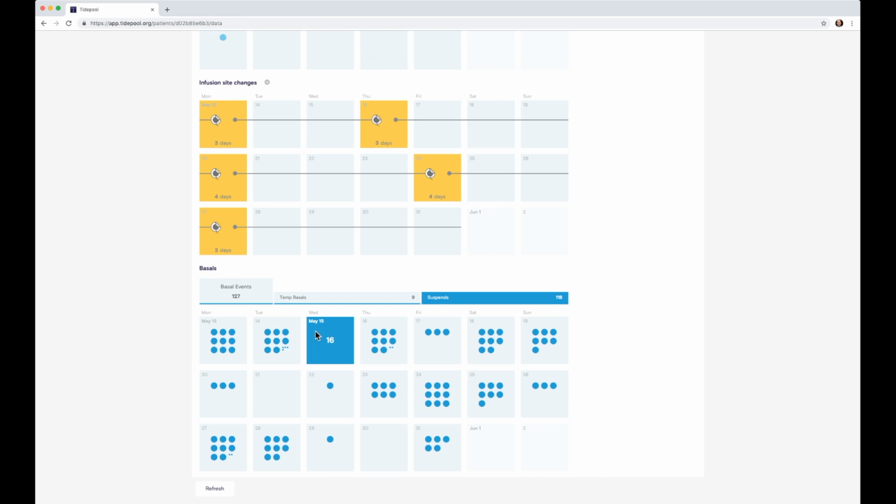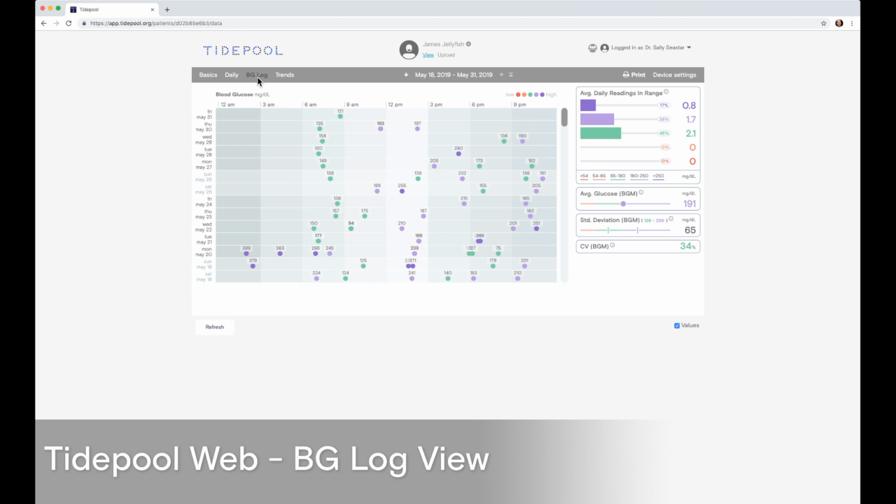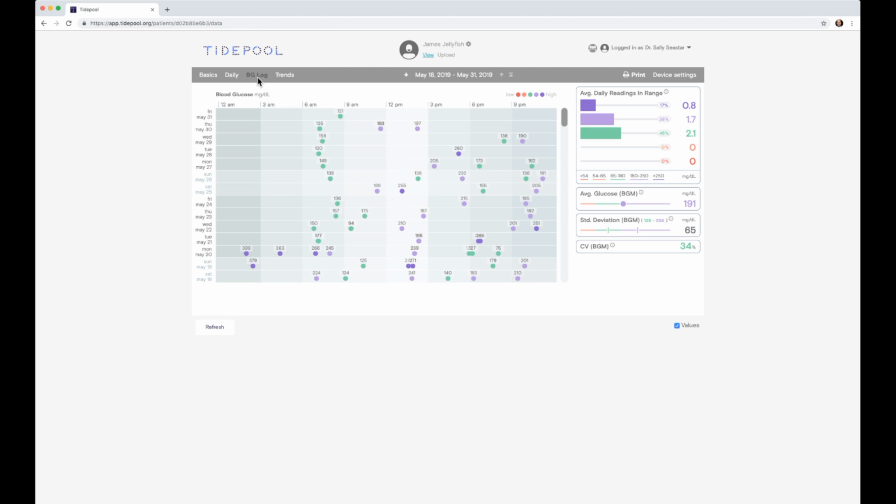In this case, on May 15th, for example, there were 16 different automatic suspend events because Basal-IQ was overriding his basal delivery. The BG log section represents 2 weeks of blood glucose log data. If your patients are uploading only blood glucose meter data, this will likely be one of your favorite screens.